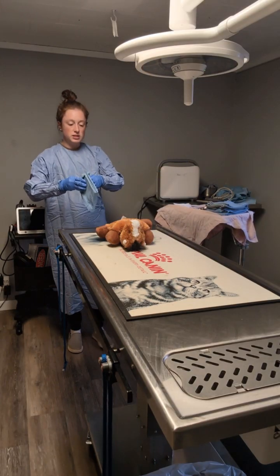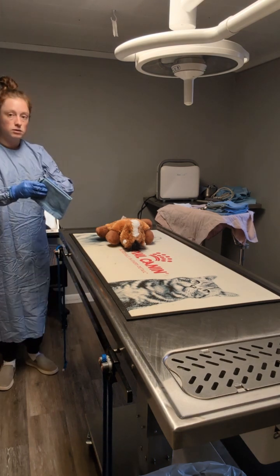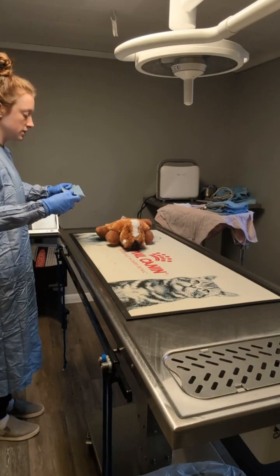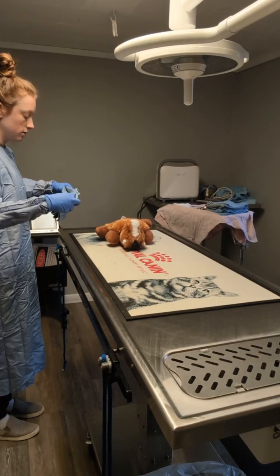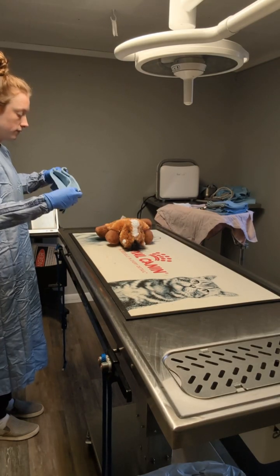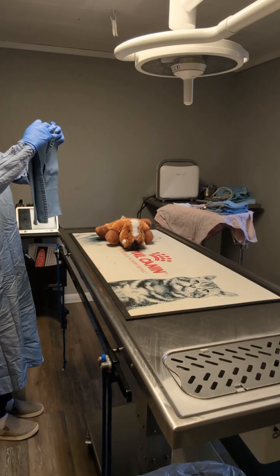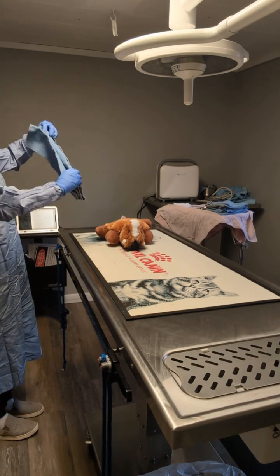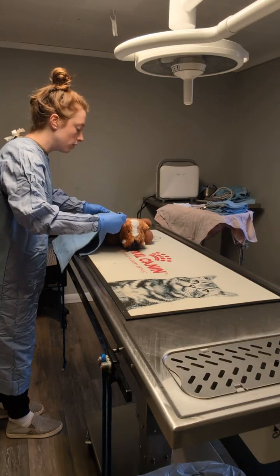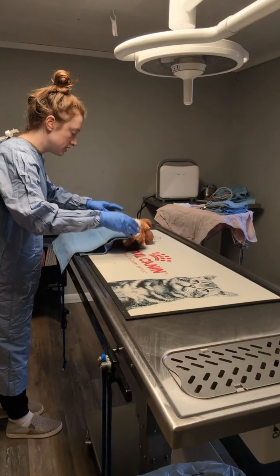To drape the patient, I want to start on the side closest to me. I'm going to set the first towel on the side closest to me laterally.